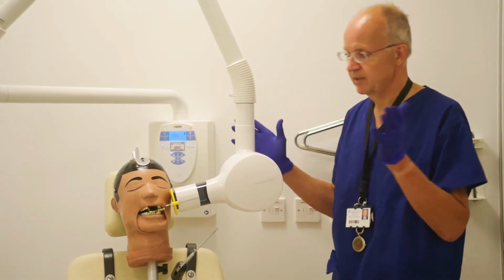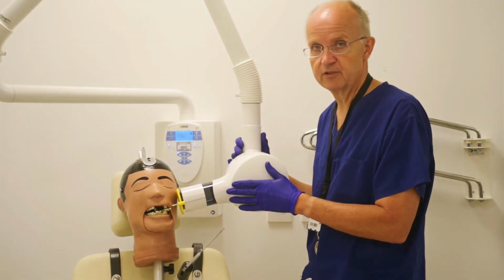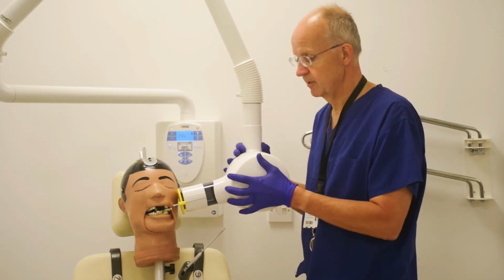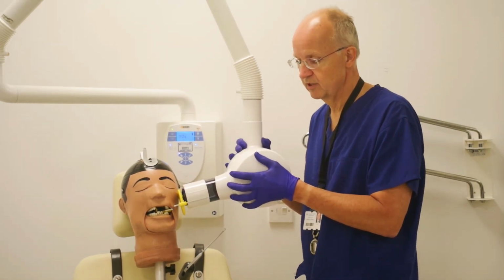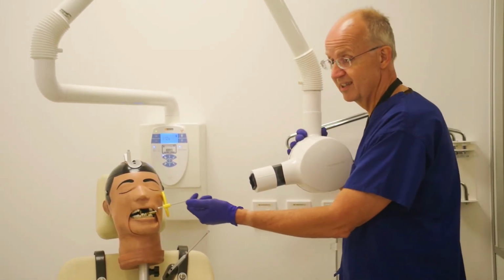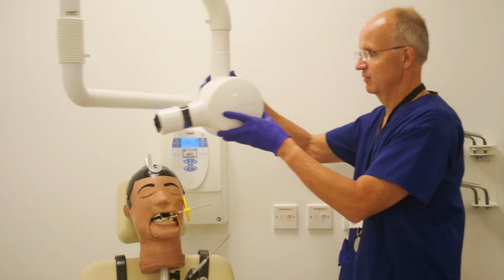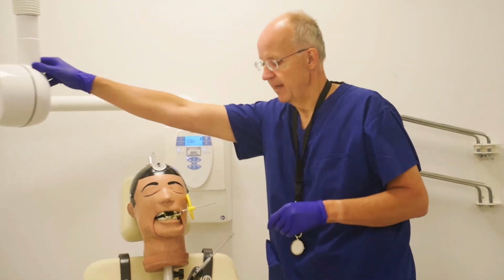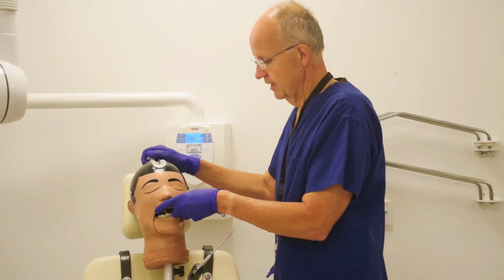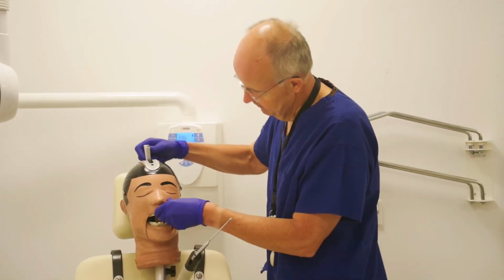Okay, so having taken the exposure, we just need to take the holder out of the patient's mouth. So come around. When you're taking the tube away, just be very, very careful to move it back and away. Don't knock this. The last thing you want to do is to knock that and jar against the patient, and they won't be very happy. And then we ask the patient to open their mouth, and very gently take the holder out.